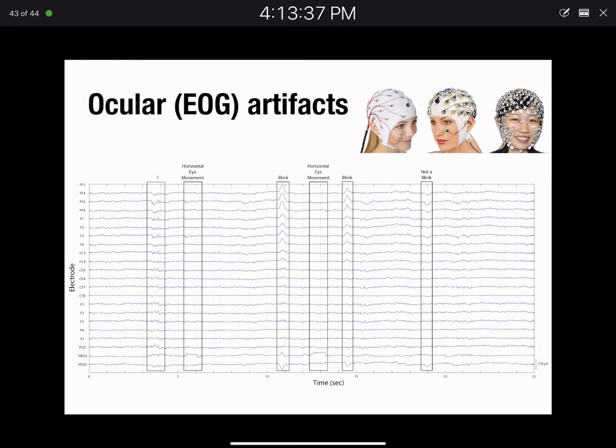What's going on there is when you blink, you close your eye, you've got a new path for current to flow, because current can flow across your eyelid that didn't exist before. If you think there's a steady state of all the electromagnetic stuff hitting your head and being conducted and so on, by blinking you're changing that current path very briefly, and that's why you get those big deviations. So it's not necessarily muscle activity, it's actually this current path change.